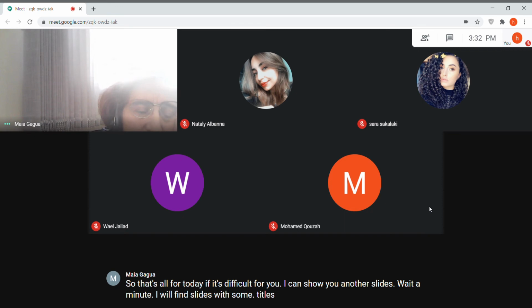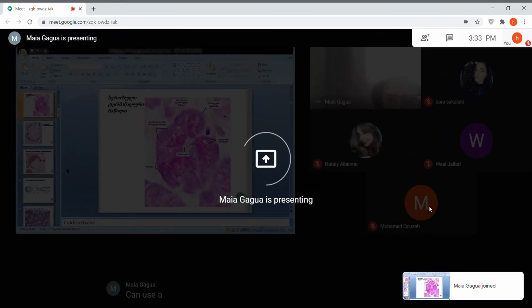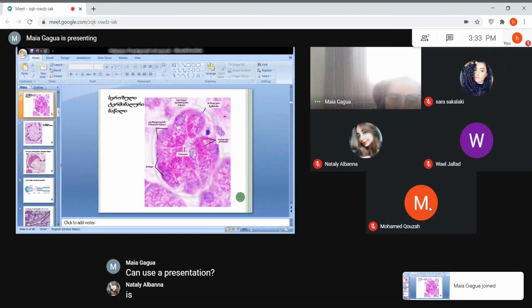Wait, maybe you will like the slides. Can you see the presentation? Yes, doctor. Let's compare once again.